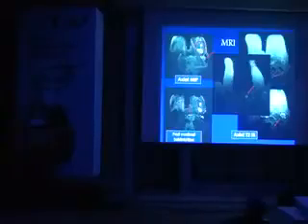More? What's this? The arrow is pointing to something. Okay. Maybe this image doesn't show you this arrow in particular, but I will show it in the video again. What's these? These are mediastinal lymph nodes, anterior mediastinal lymph nodes, or peri-aortic lymph nodes as well. So 1, 2, 3, 4, and 5 within the manubrium. So this lady has got a multi-centric tumor with axillary nodes, with bony metastasis, with mediastinal lymph nodes.